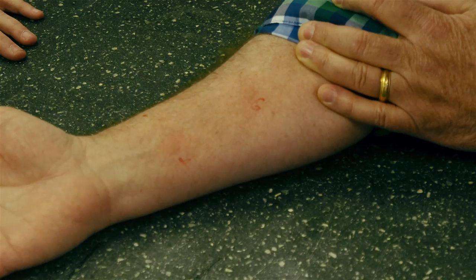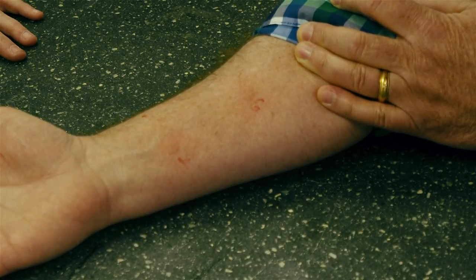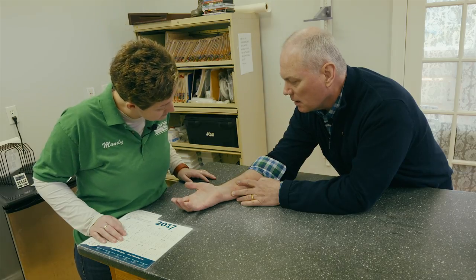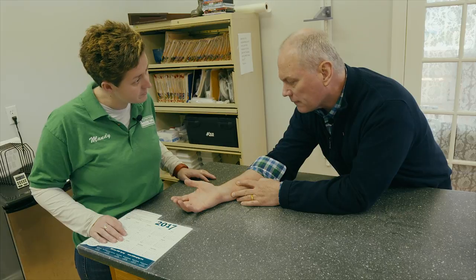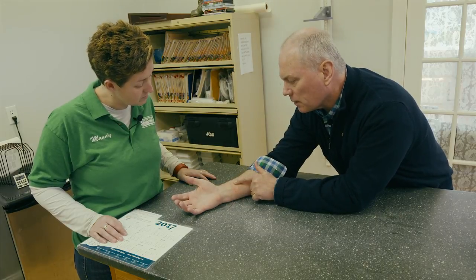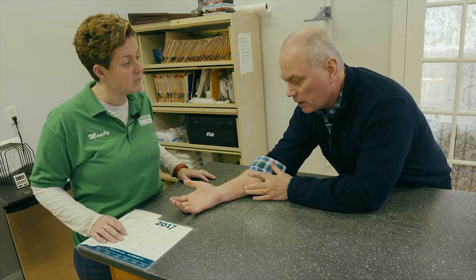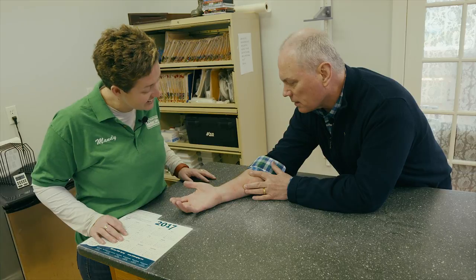Sounds good. So we've waited, and as you can see, there are definitely welts on Dr. Gels' arm here. So as you can see, he's definitely allergic to grass. This is a positive test. We do this on everybody just to make sure their skin is reasonably sensitive enough to testing. That was histamine, it's supposed to do that. This was saline, and there's nothing really there. But this G here stands for grass, not for Gels, but it is a good sized welt. And I'm allergic to grass, I can tell you that.